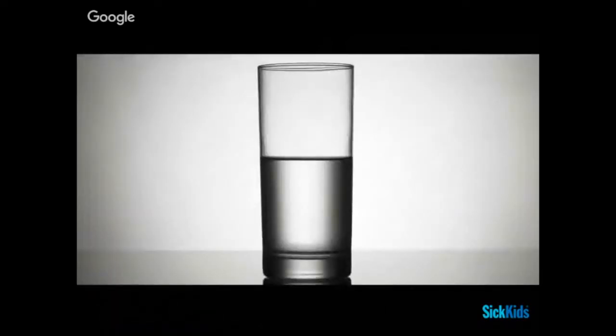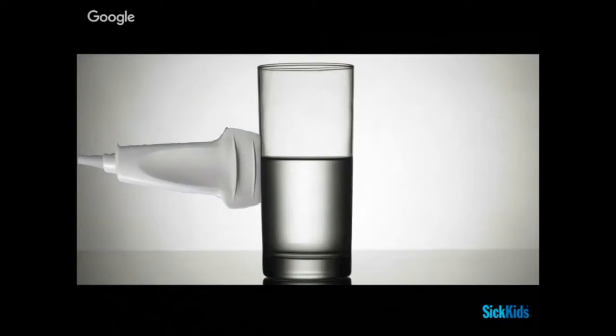To give you a better understanding of how we want to think about sinuses in terms of ultrasounding them, we like to use a glass of water. So whether this glass is half full or half empty, we're going to try and look at the air and the water with our transducer. In putting our transducer as we would on the face, we can assume that what we might see is nothing much through the air, as we know air is not the friend of the ultrasound machine, but we may be able to see quite a bit deeper in the area that contains fluid.